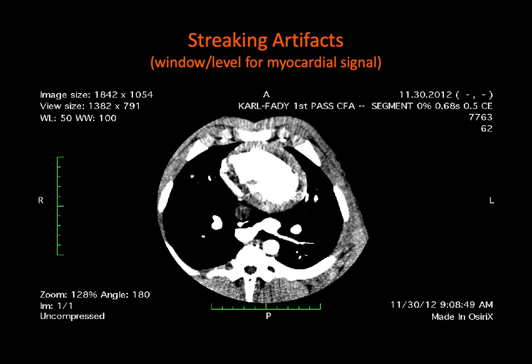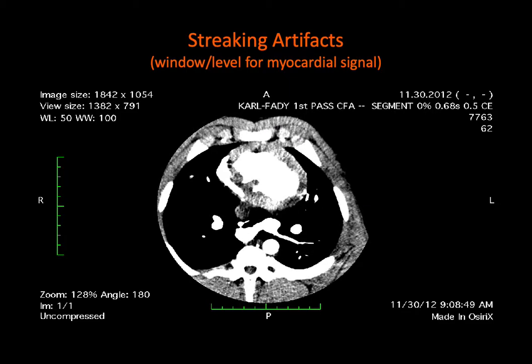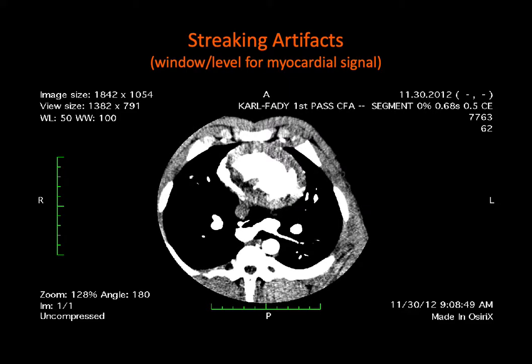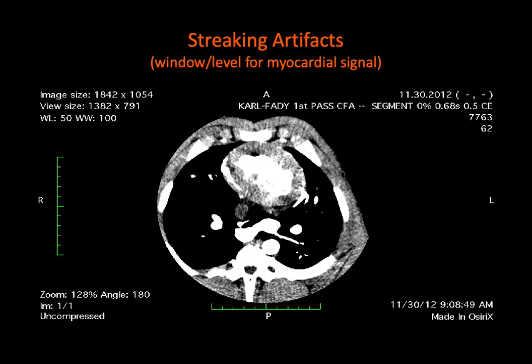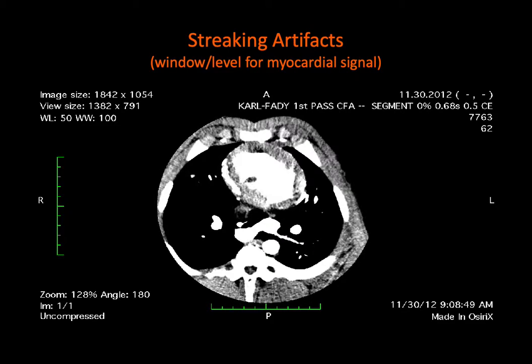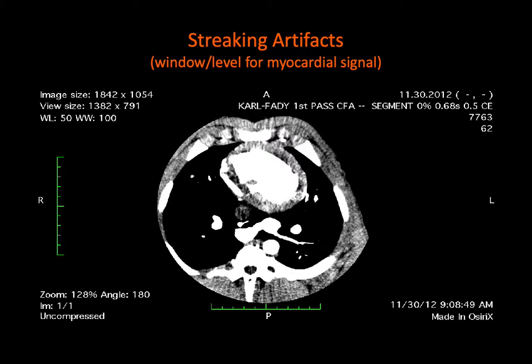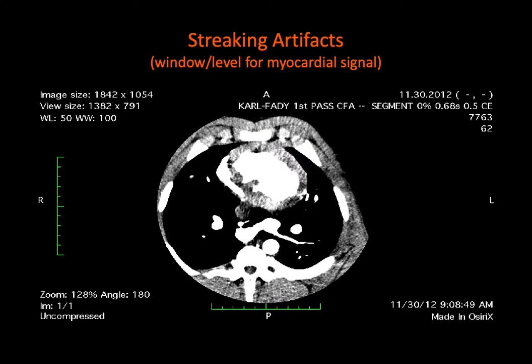Okay. The other thing is that this is all one heartbeat, right? This is like the heart's beating. So the time scale is 1 second, right? This is not the perfusion time scale. And so in theory, all of that attenuation should be the same within a second. Right? The perfusion has already come and gone, or it's flattened out. And so these variations are too fast, basically, for the time scale you're talking about.